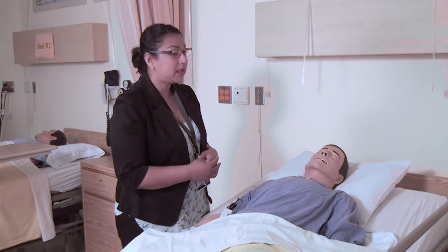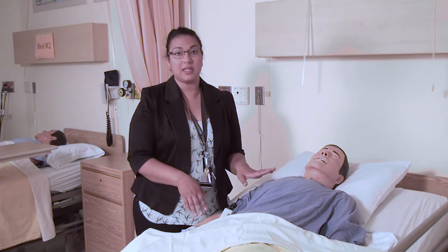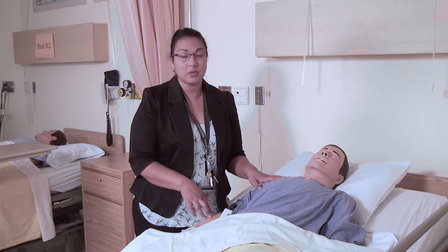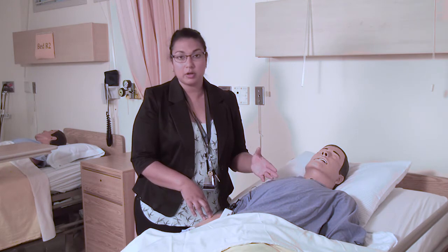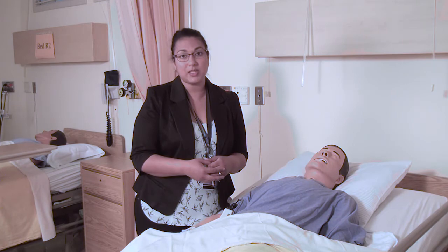And then it's also really important to notify your patients that only the patients should be pressing these buttons. Nurses are not supposed to be pressing them, and neither are family members supposed to be pressing the buttons. The only exception is with pediatric patients. That's when you would have either a nurse, a parent, who would be able to press the button for the child.